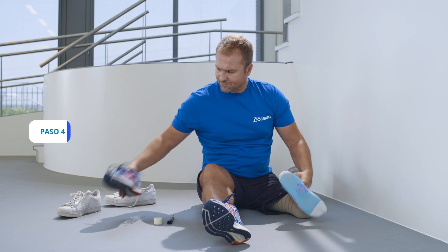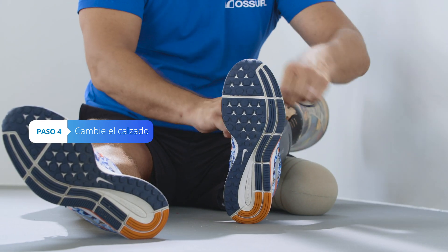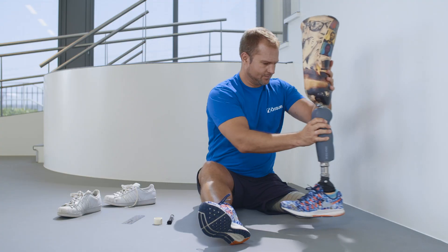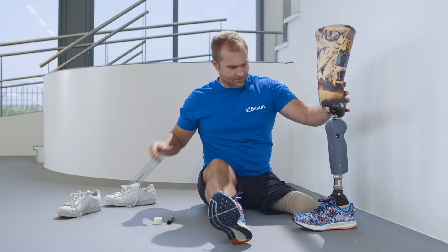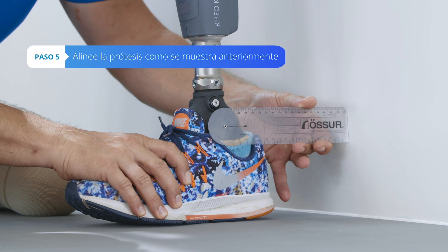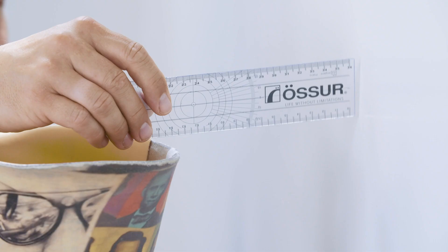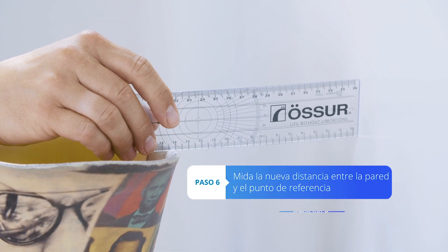Change the shoe on the prosthesis to the one you would like to wear. Align the prosthesis by using the ruler to the wall as explained in Step 2. Measure the new distance between the wall and the reference point on the socket.